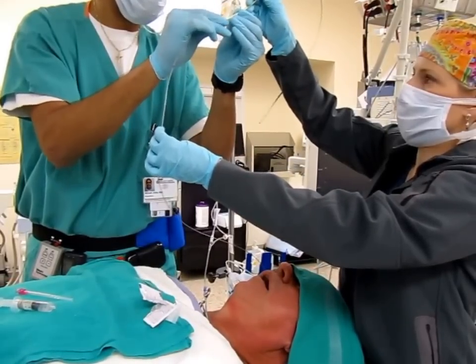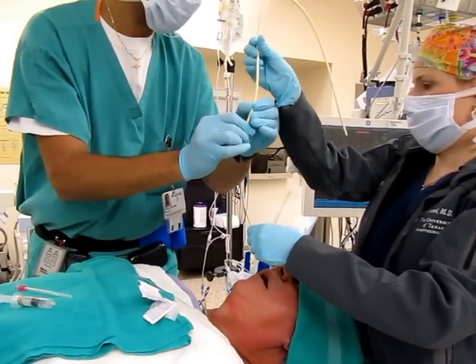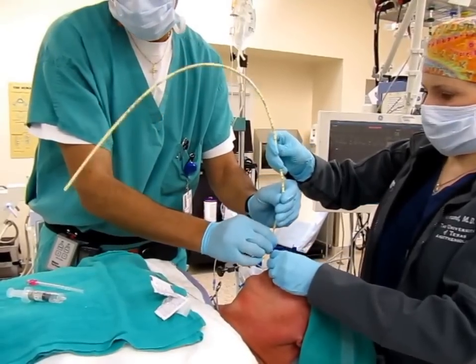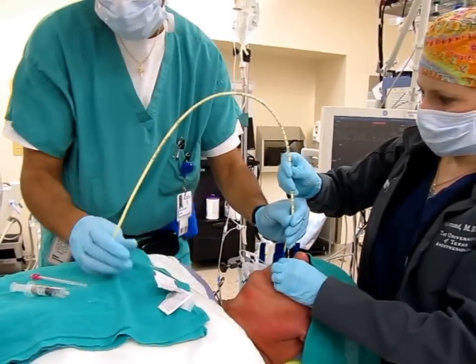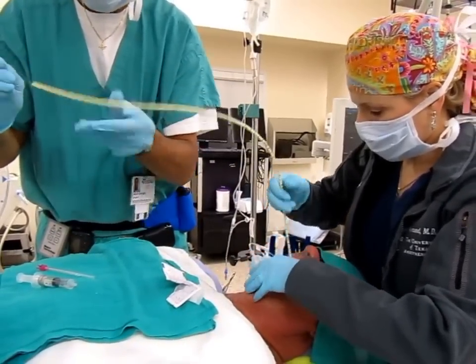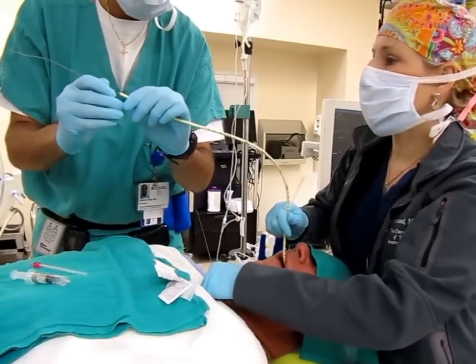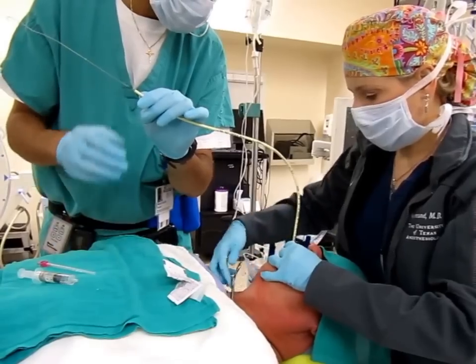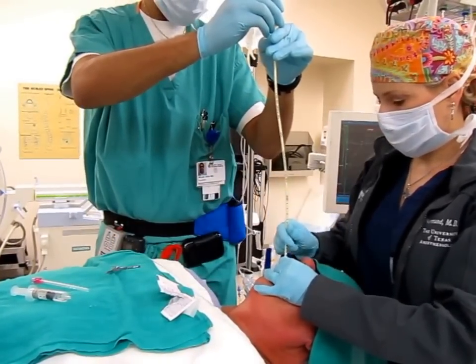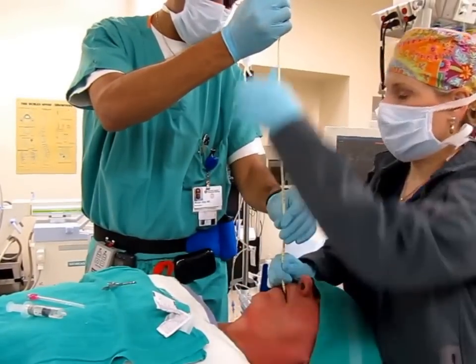Move up the cook catheter. The guidewire's length is marked with another black line — you want to see that black line. So what we're going to do: I'm going to let go of the tension on this — keep nice tension on it. I'm going to let go of the hemostat. Now you're going to pull and push at the same time. You can't push yet until the guidewire is out of the skin — it's preventing you.